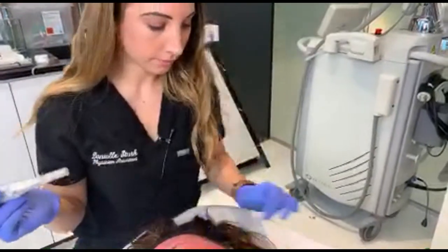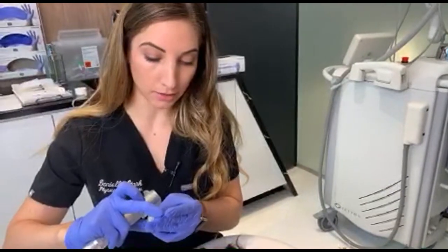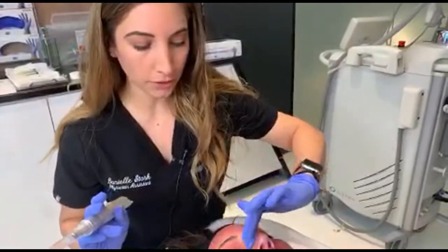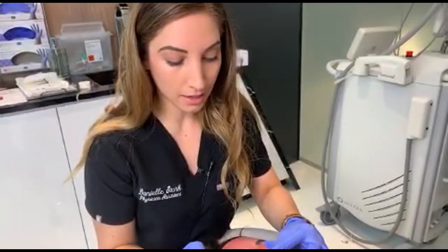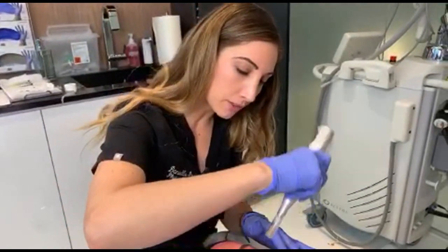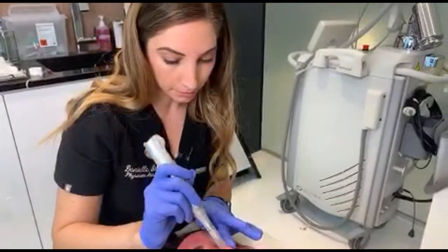When you do microrolling at home, how often should you do it? Once a week is ideal. And it can change. Go ahead and put your head back to the center. It can change for different patients depending on what your needs are, what your skin type is. But for the most part, just once a week is enough to tell your skin to start to turn over and kind of kick back into shape.